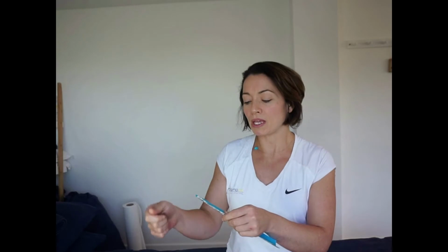And remember, this tape is about us prolonging our results and helping keep some of the results we get in our hands-on sessions. We want to ensure it lasts as well as possible. So, two things to look out for. One, quality of the tape, and you can tell that straight away. When you look at the cheaper tapes, you peel them off, you can tell that once you stretch them, they've lost that recoil. You can't re-stretch them, the quality's just not there. And secondly is, it doesn't stick very well to the skin.